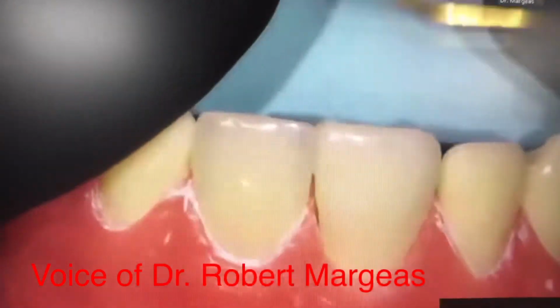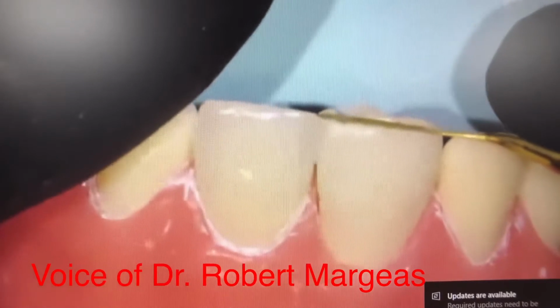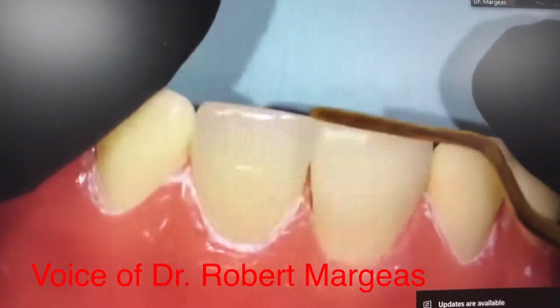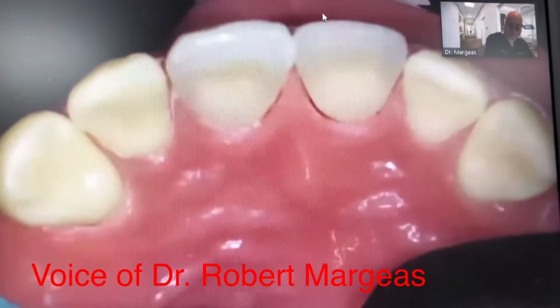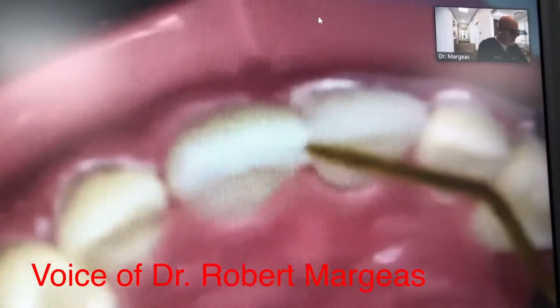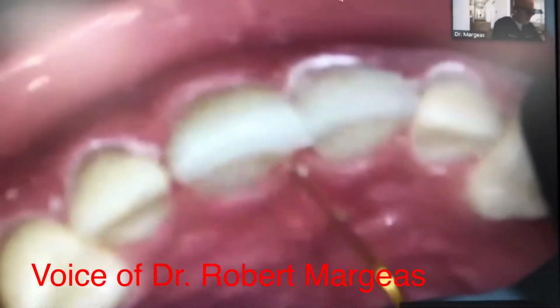Okay. So leave some more off. I can look from the incisal, and you can see I'm going to have room for finishing and polishing. Alright, so you can go ahead and we can do that as I finish this up a little bit.